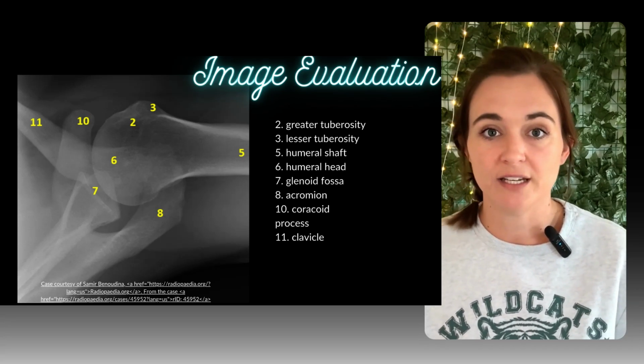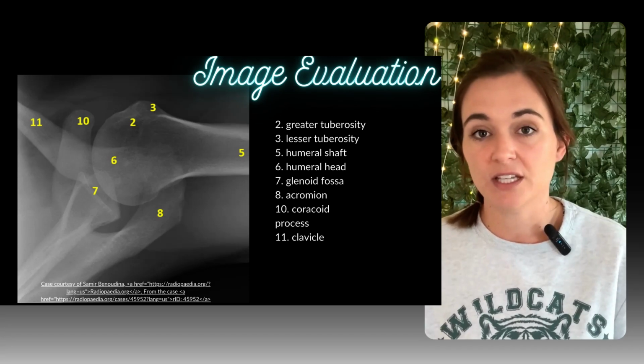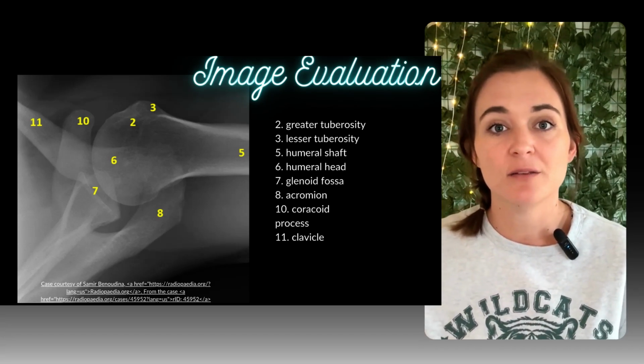There's no grid needed. Use tight collimation and 65 to 70 kVp. If the patient can't abduct, consider a Clements-Nakayama. And that's your 4-view shoulder series: AP external, AP internal, scapular Y, and Inferosuperior Axial.